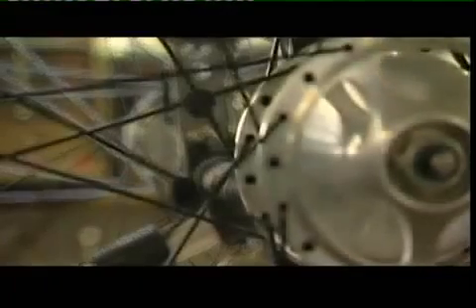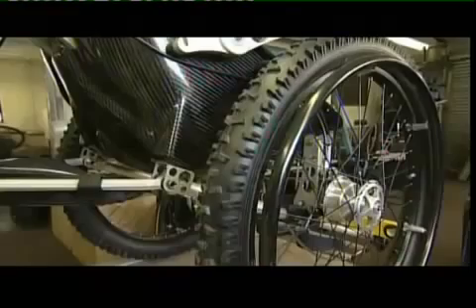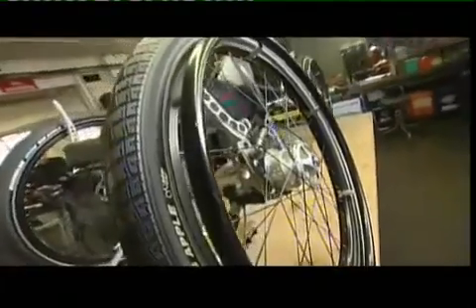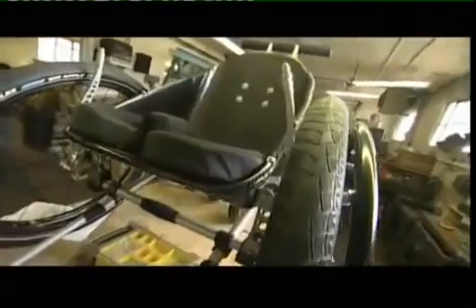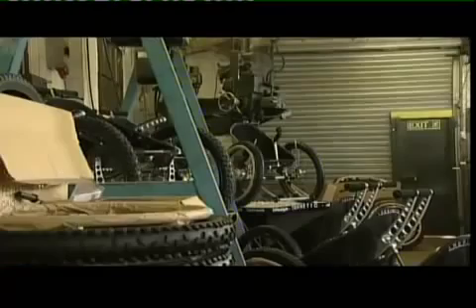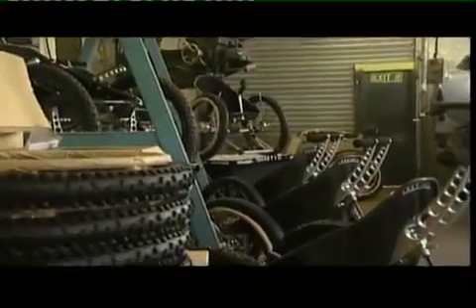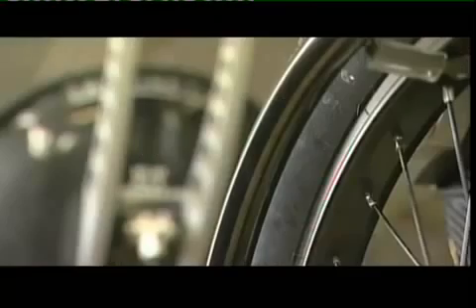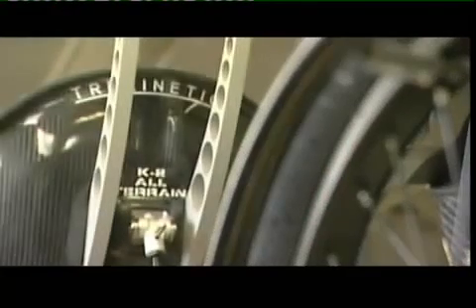In 2003, Mike finally felt the Trekinetic was ready to unveil. He invited a group of wheelchair users to the Aspire Centre in Stanmore to take a look. Mike's unusual three-wheel design had borrowed from Formula One technology to create a lightweight carbon fibre monocoque seat, which was curved for comfort. Initial responses to the wheelchair were positive.